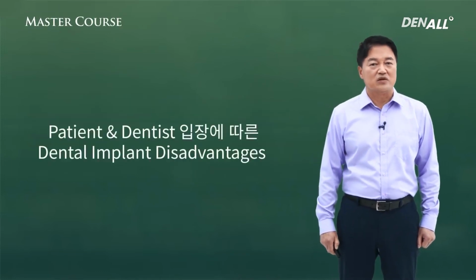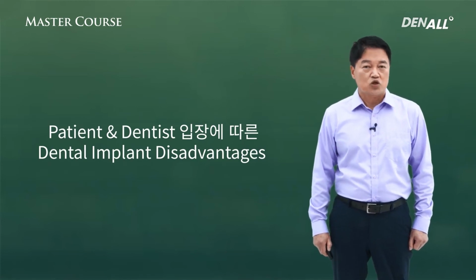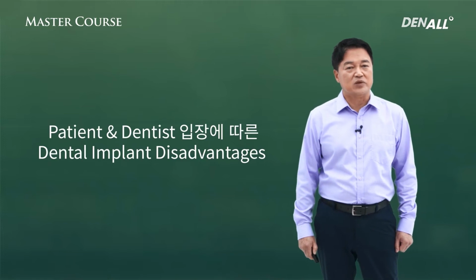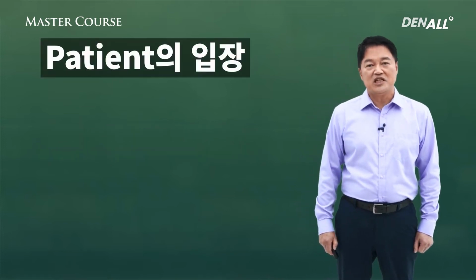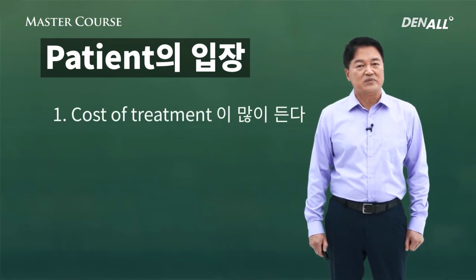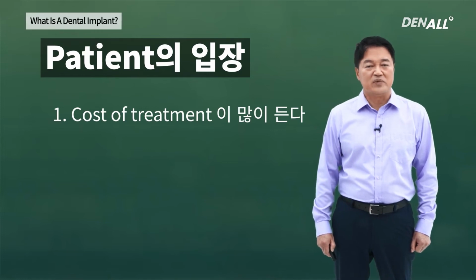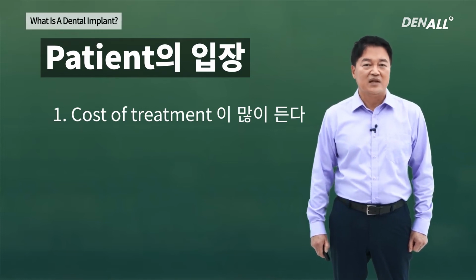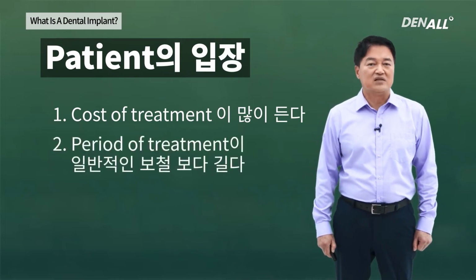Implant is not without shortfalls. Let's look at disadvantages of implant depending on patient and dentist perspectives. From the patient perspective, first, the treatment cost is quite expensive. However, these days, implant treatment can be insured and the treatment cost has been reduced, so this is not a huge factor. Second, treatment period.